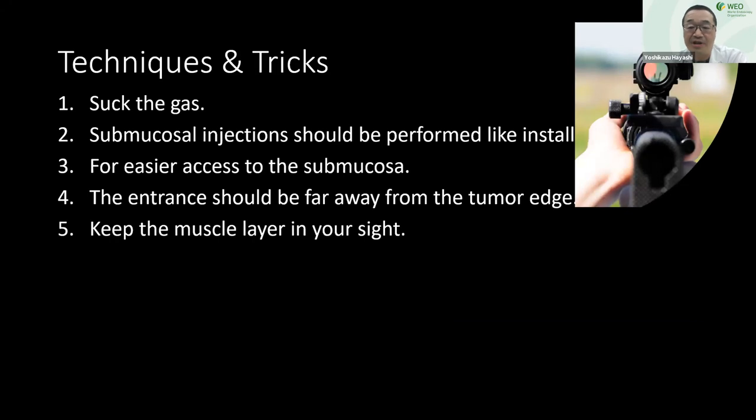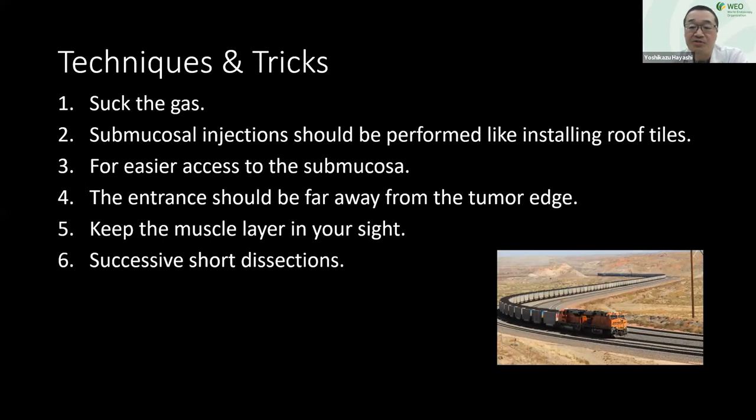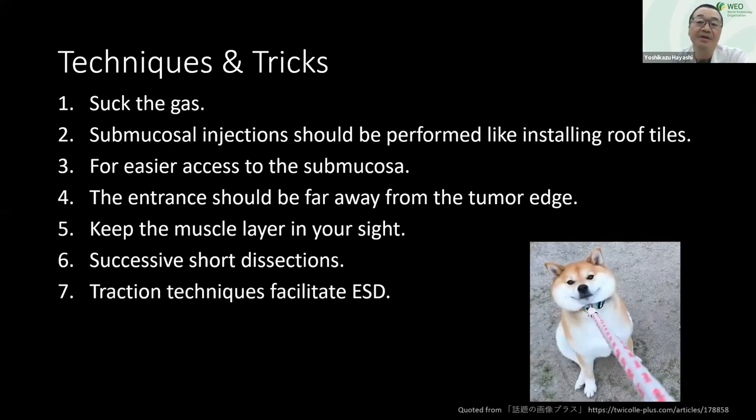Keep the muscle layer in sight. Don't damage the muscle layer. Succession of short dissections makes a safe and precise dissection line. And finally, traction techniques facilitate ESD.